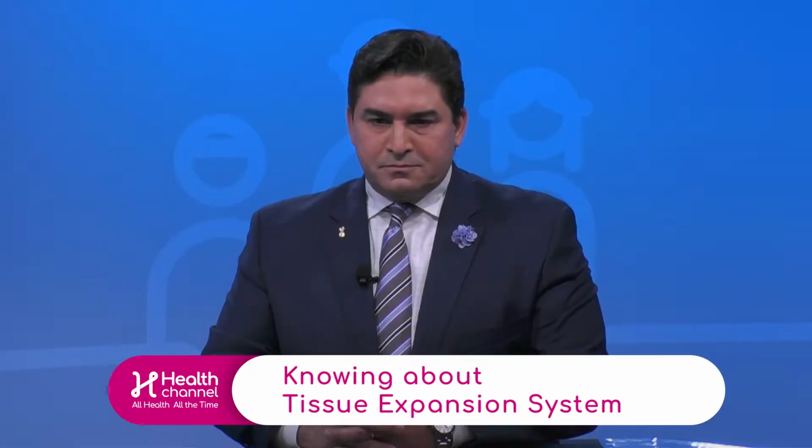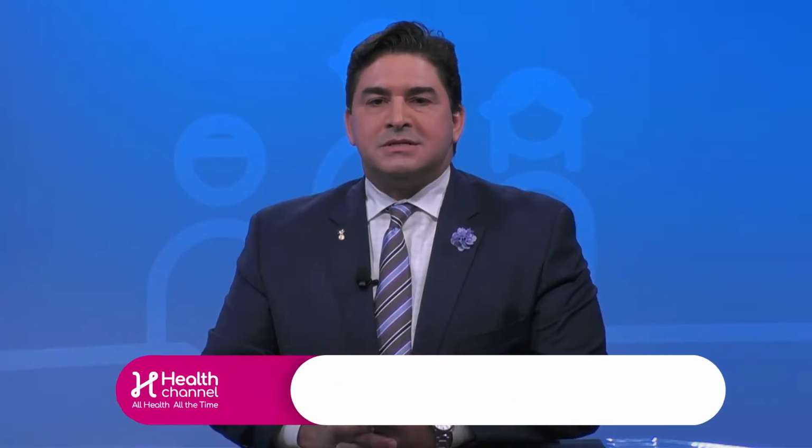I've heard the phrase tissue expansion system. Would you explain that and why and when you would use that, what that is? Well, tissue expansion in general is a process that is performed to expand skin and sometimes even muscle, to expand soft tissue, very often to accommodate an implant.